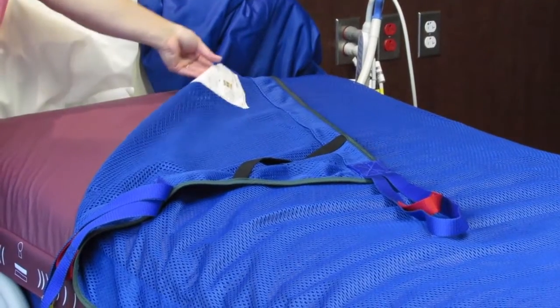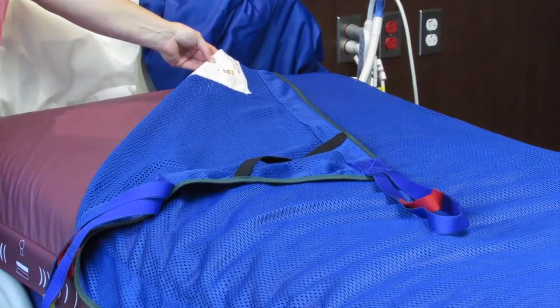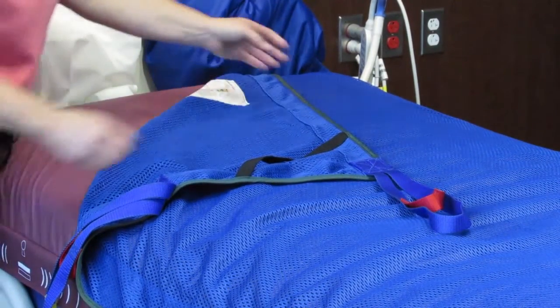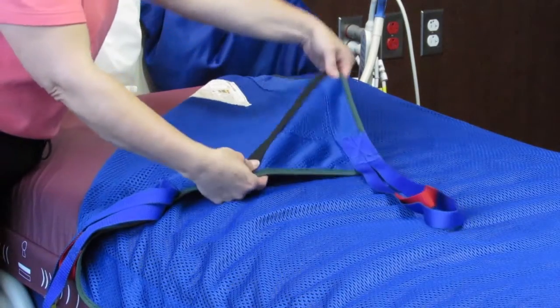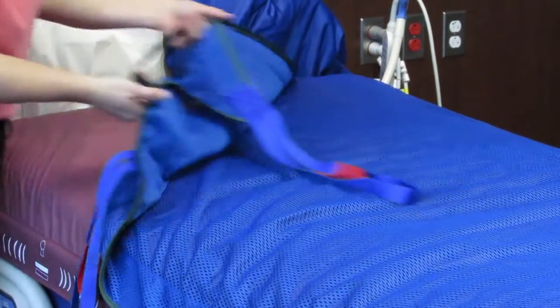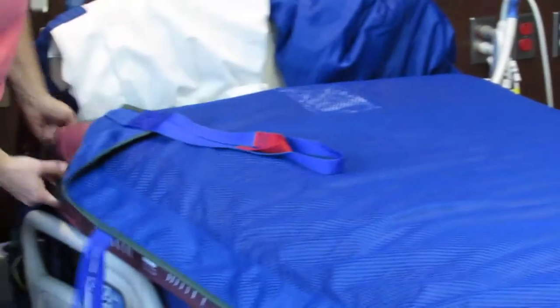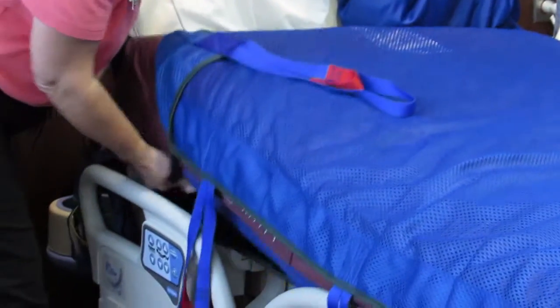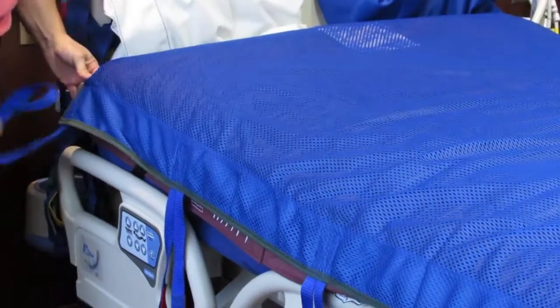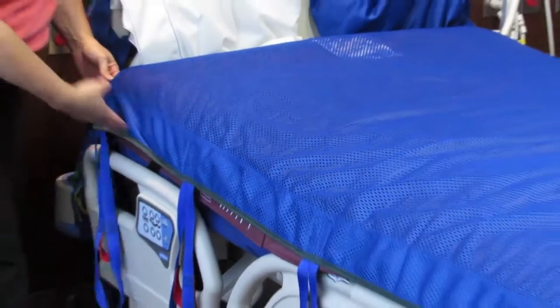Make sure the label of the sling is at the head of the bed and facing away from the patient. The repositioning sling is available with elastic corner straps, used to secure the sling to the bed and reduce wrinkling of the sling under the patient.